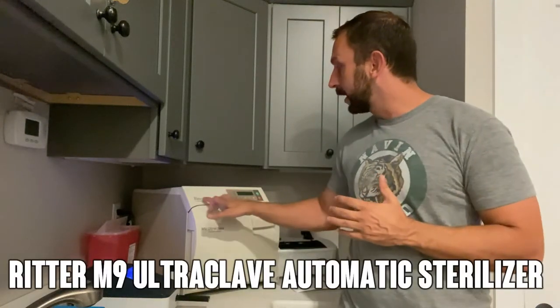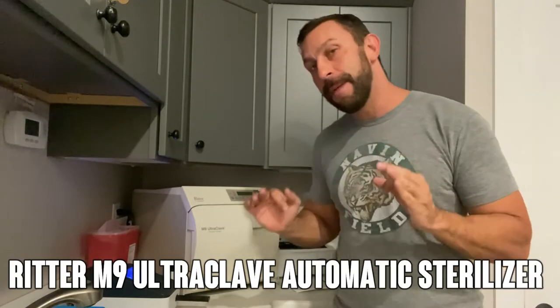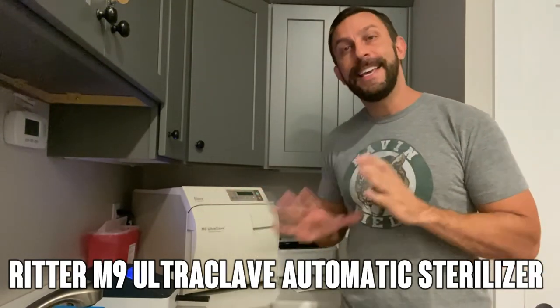Hey folks, Adam here, and today we're looking at the Ritter by Midmark. This is the M9 Ultraclave, and this is a great, easy-to-use sterilizer for professional settings.